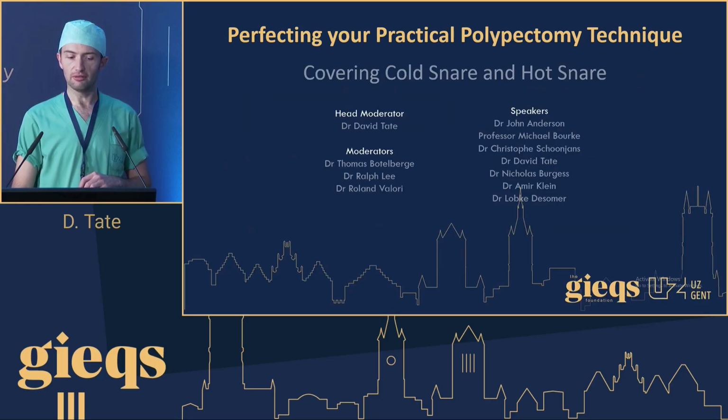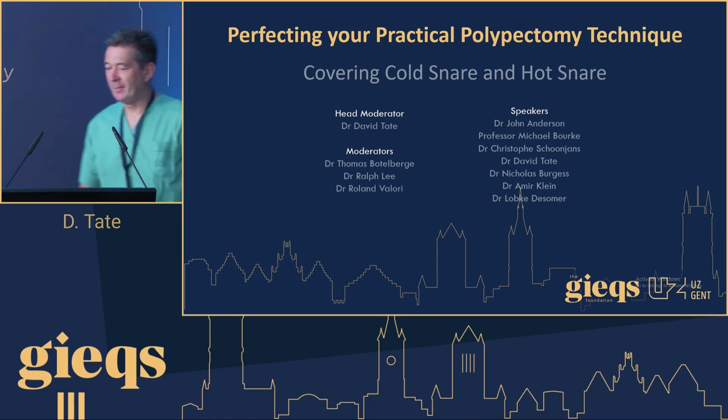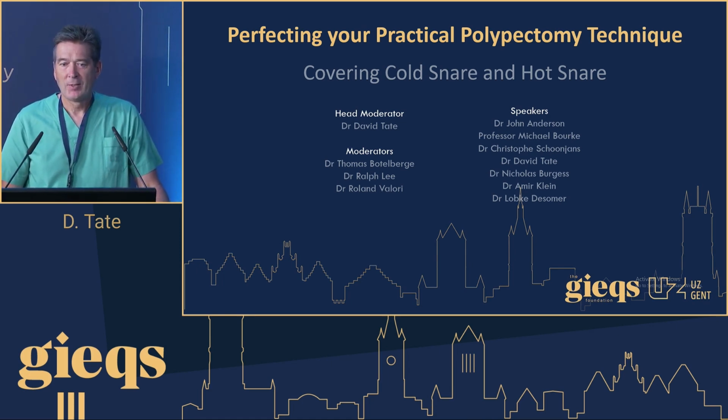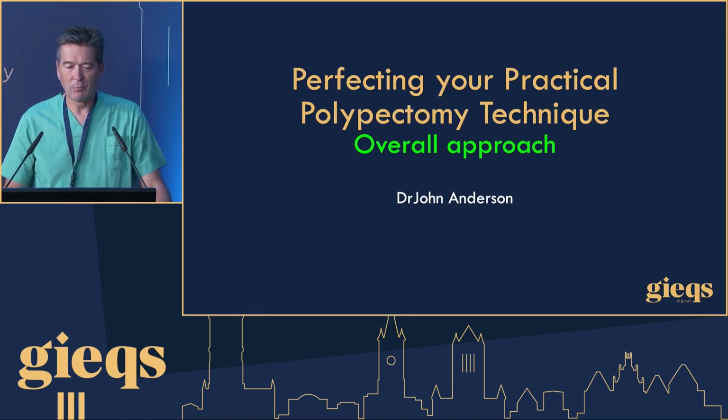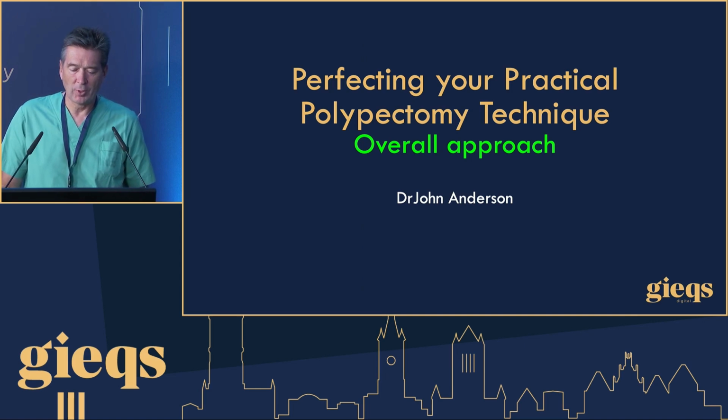All right, without further ado, John, tell us about the 4 Ps. Thank you, David. I do like a little bit of an acronym. If we could have the first slide, please. So I'm going to really take a general approach and use some language Roland was just talking about in the previous session, and this is just really an overall approach to polypectomy.